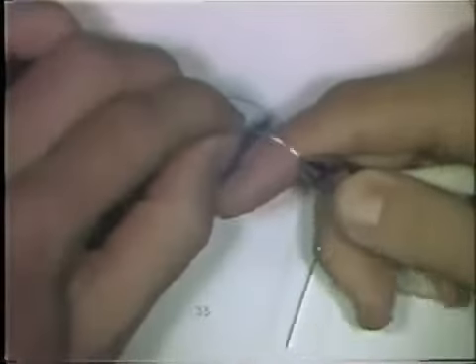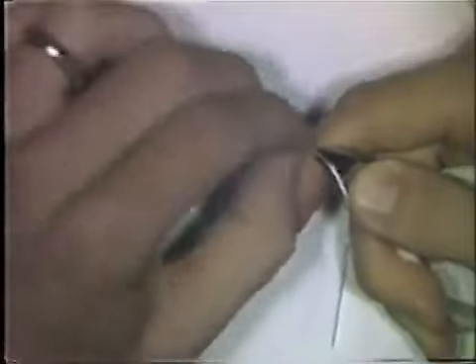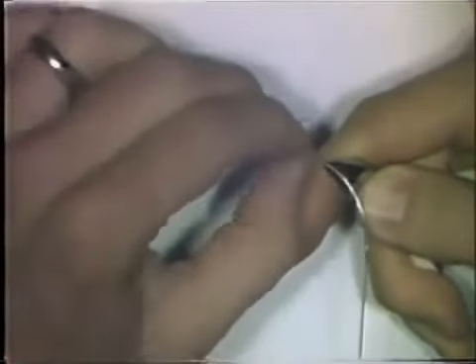Now, you can do some of this adaptation with your finger too. Again, using the pliers as a vise and smoothing the wire with your thumb and finger. This takes some practice.